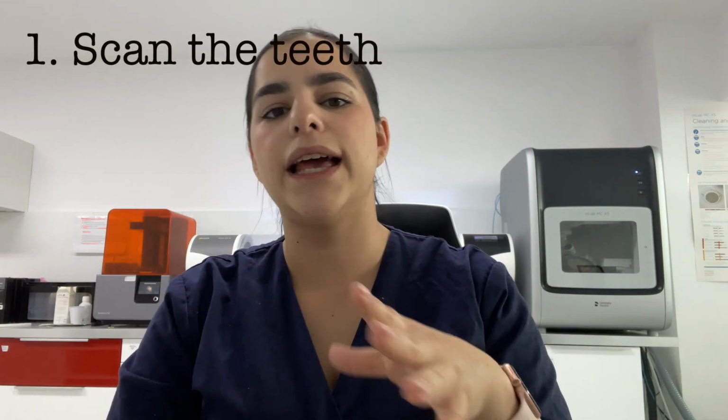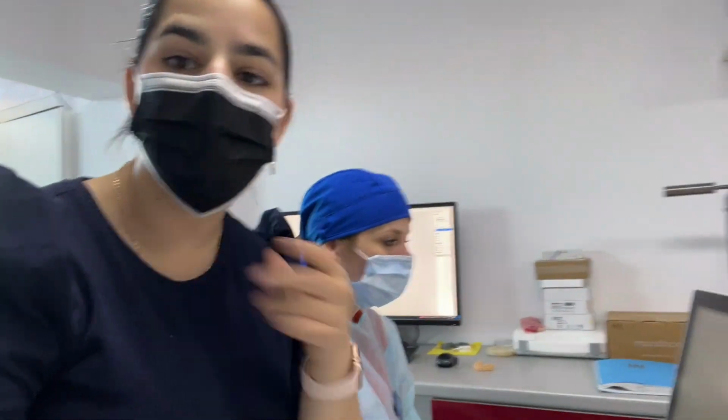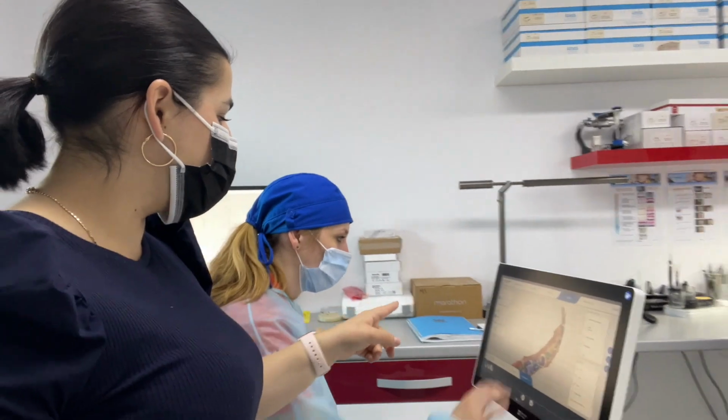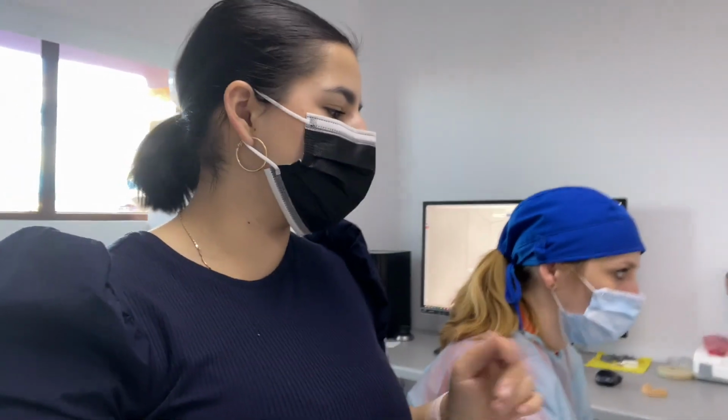And to make a surgical guide, you need a few steps. So the first step is that you have to scan the patient, and that's where you actually work the future prosthetic work. I will show you now what that is about. Okay, and you're also gonna see when we scan, the patient has one tooth there that we want to be extracted, but we only do the extraction while the surgery is going, so we only virtually extracted the tooth.